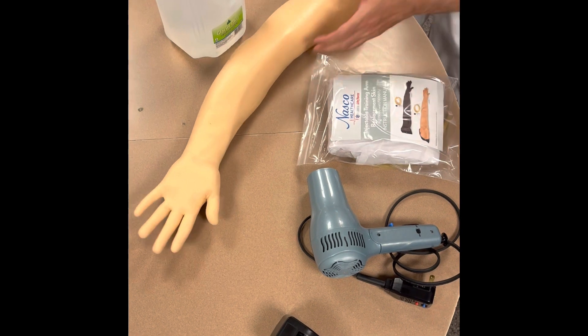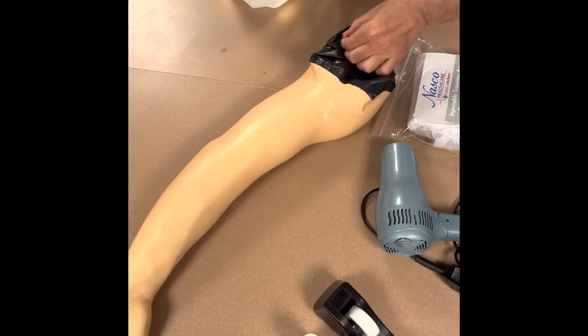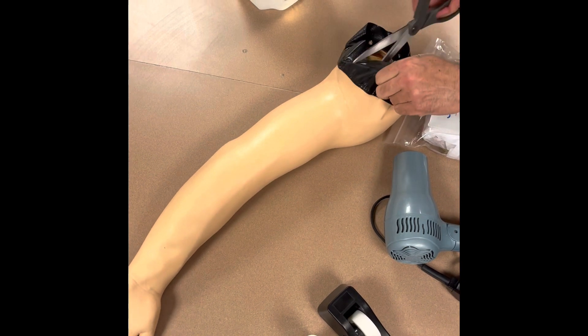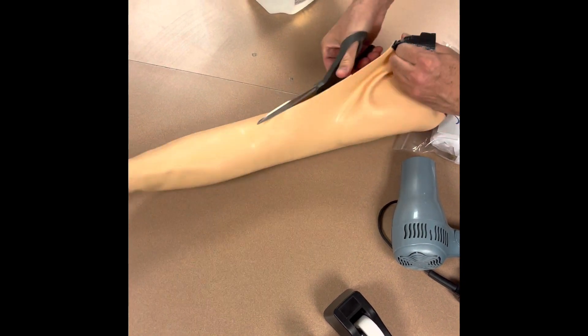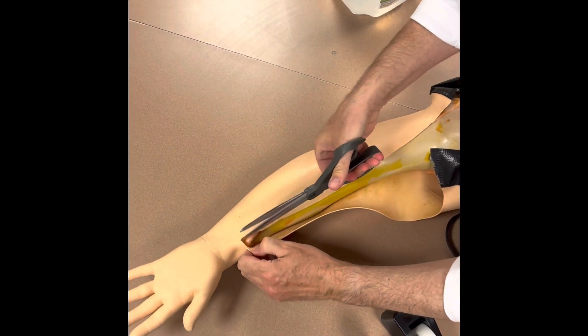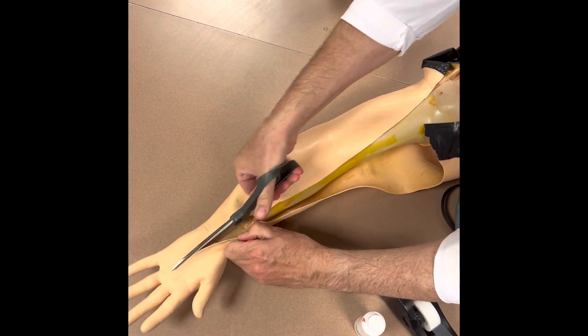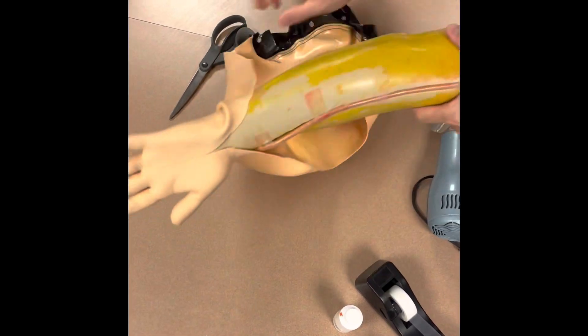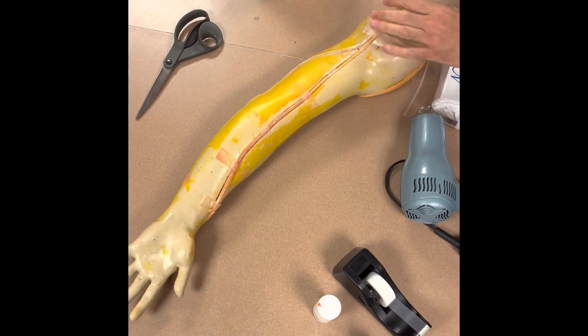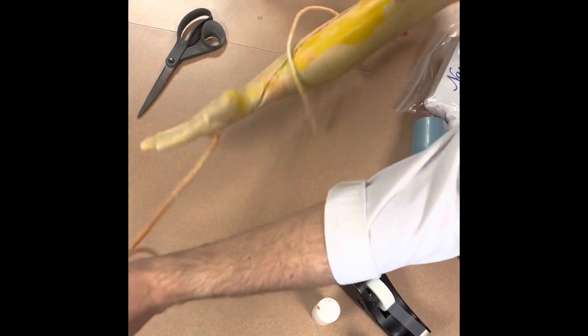First thing you want to do is cut off the shoelace that keeps this together. Zip off the skin — be very careful that you don't cut yourself. Always cut away from yourself. Pull the skin off and discard it.